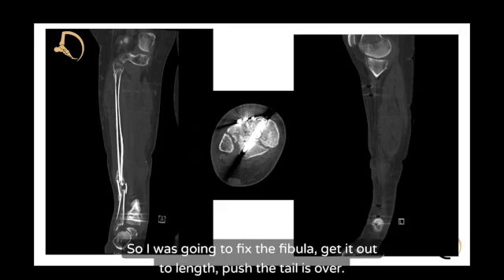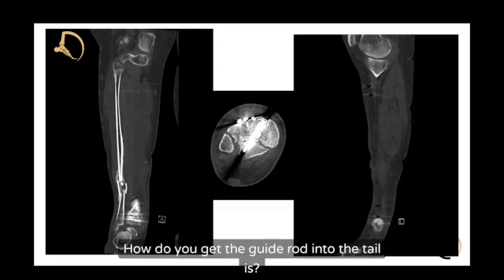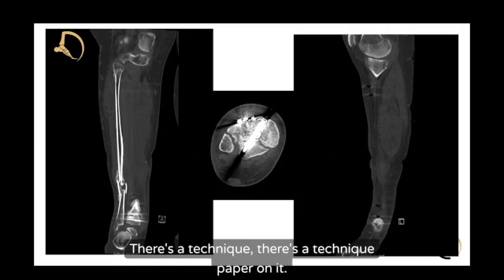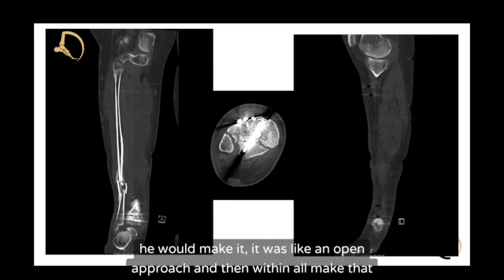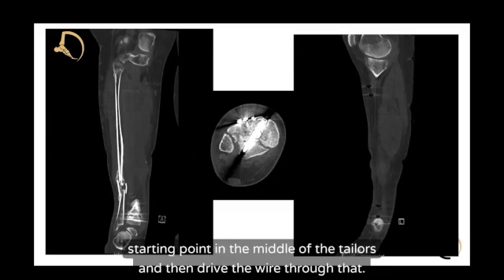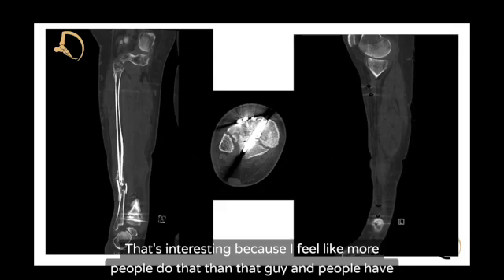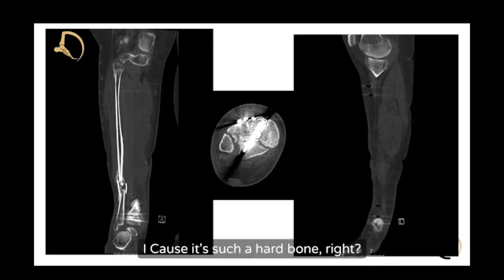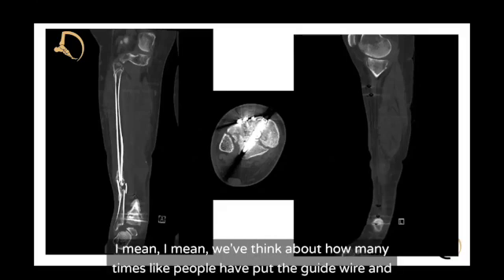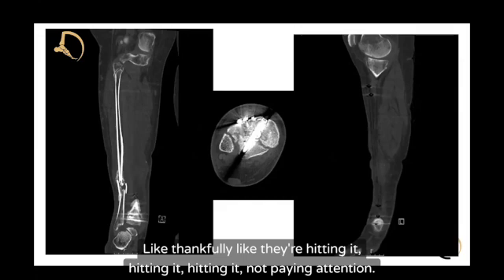The plan was to fix the fibula, get it out to length, push the talus over, and then have the nail re-driven down into the talus. The question is how do you get the guide rod into the talus — there is a technique paper on it by Richard Freeman, published recently and posted on LinkedIn. It's an open approach where you make the starting point in the middle of the talus and drive the wire through that. He has a case series and is out of the UK. The challenge is getting the guide rod down into such hard bone and centering it — the guide wire can easily miss the plafond if you're not paying attention.